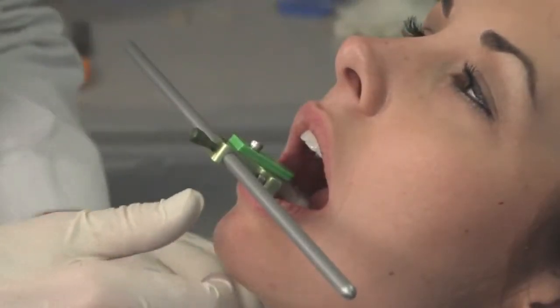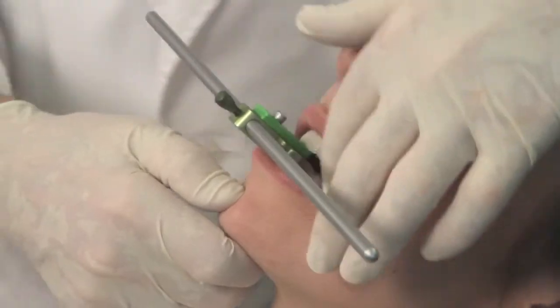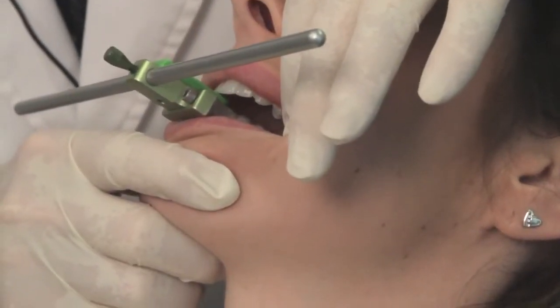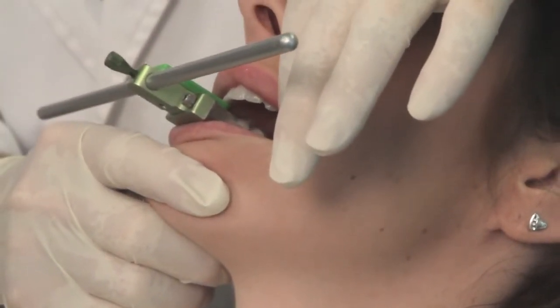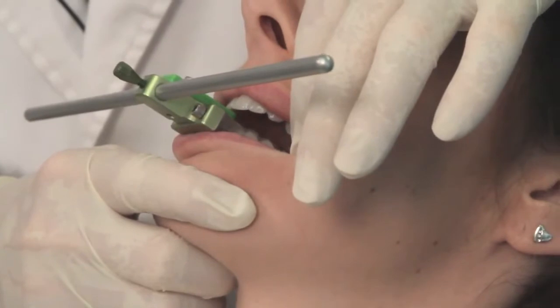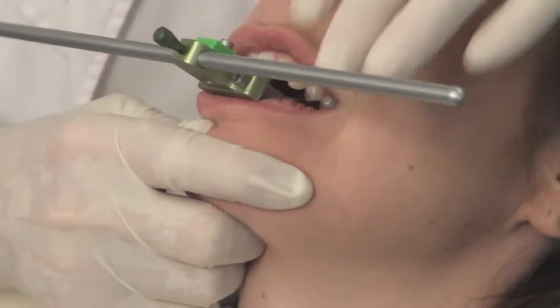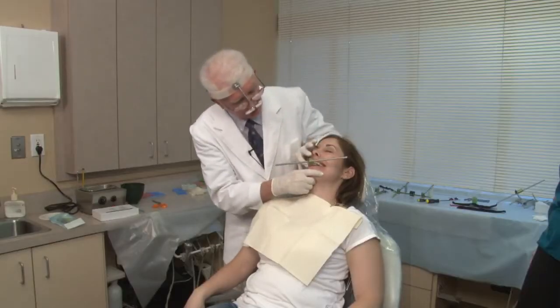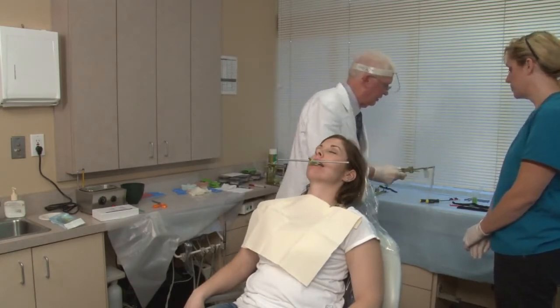Okay, now close for a minute. Oh, perfect. Now look at the posterior area. Okay, now I'm going to have the patient move to the right. Move to the right. Keep moving. Keep going. Notice the posterior teeth are clearing the clutch very nicely. Now move to the left. And again, no contact in the posterior area. Okay, now we'll put on the flag assembly.